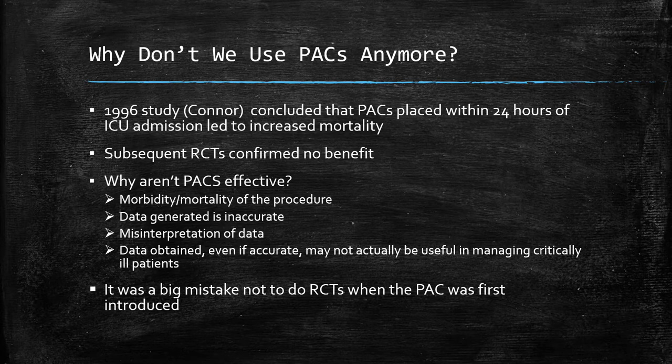Probably the biggest problem is that the data that's generated is now known to be inaccurate. We know that the measured pulmonary capillary wedge pressure really doesn't reflect the patient's reality. Cardiac output can be off by as much as 80% by the thermodilution technique. So it's likely that we're just getting inaccurate data.